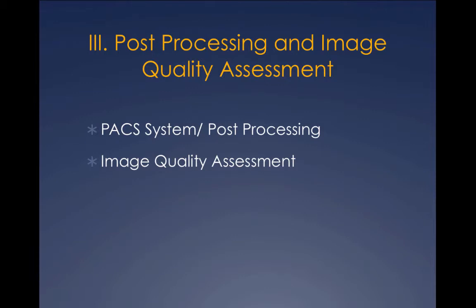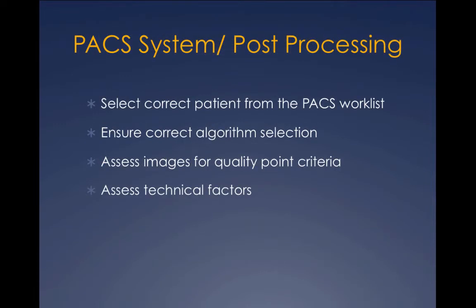Part 3, post-processing and image quality assessment and the topics that will be covered within. PACS system and post-processing. Now that you've achieved an image on your cassettes, ensuring the following occurring in this order will be the first step to a completed exam.